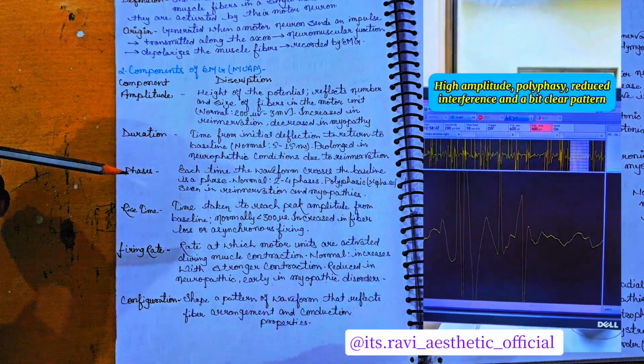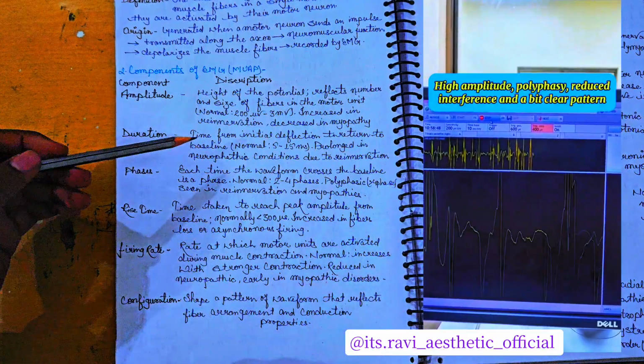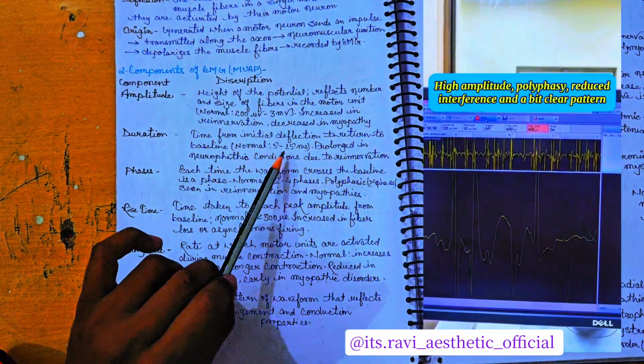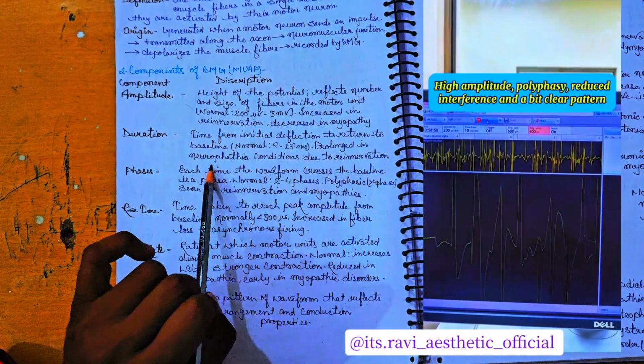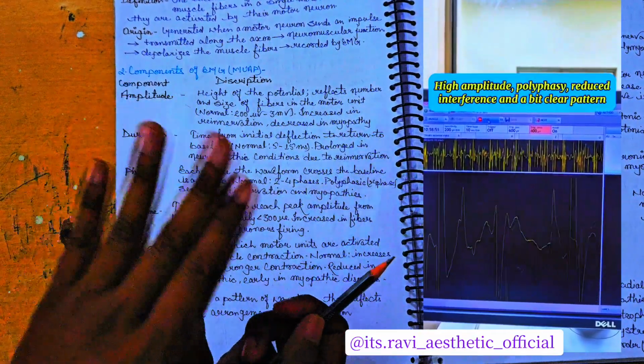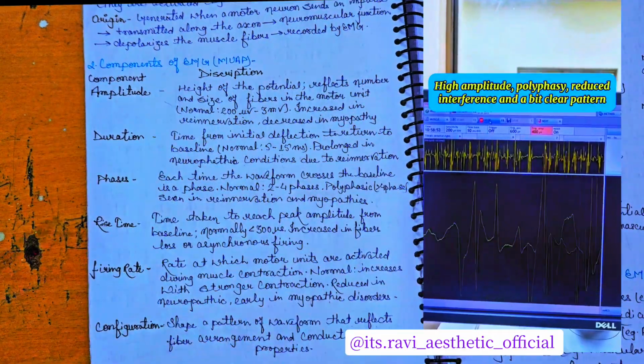Next is the duration we have to find out for the skeletal muscle producing a motor unit action potential. It is the time from the initial deflection to return to baseline. Normal is 5 to 15 milliseconds, prolonged in a neuropathic condition due to reinnervation.